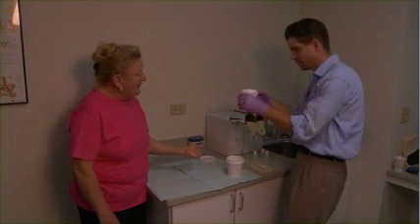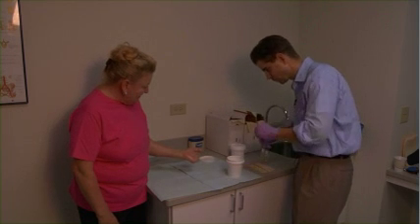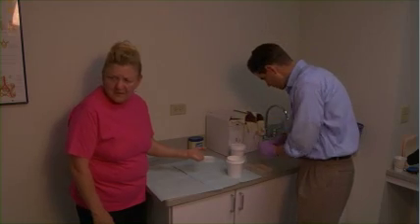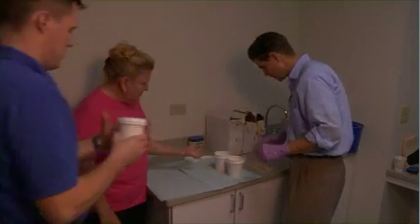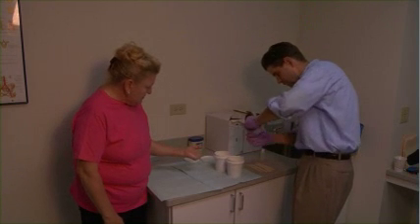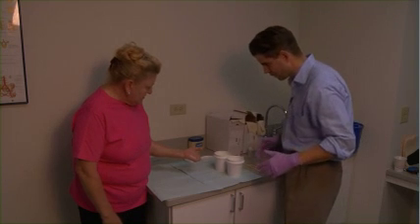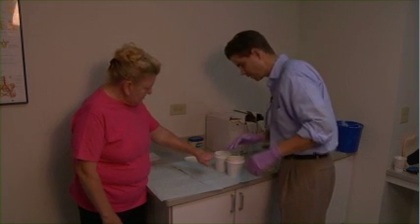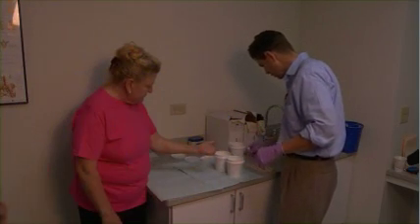I don't know if there's a seal on there or not — that other one came off really easy. Twist off. You want to go ahead with the third one just in case. I'm going to get my catalyst. This is the catalyst; we should have plenty of working time. We may be all right with two, but I'll get three ready.